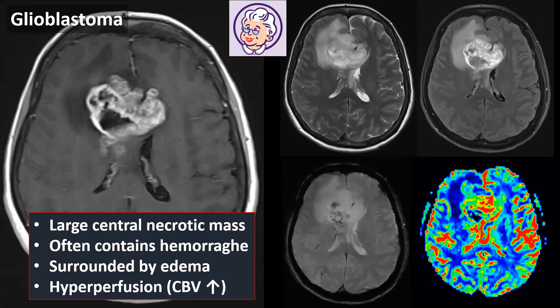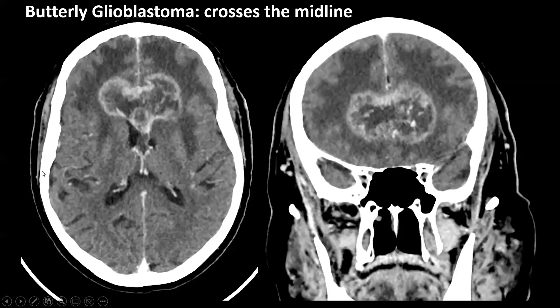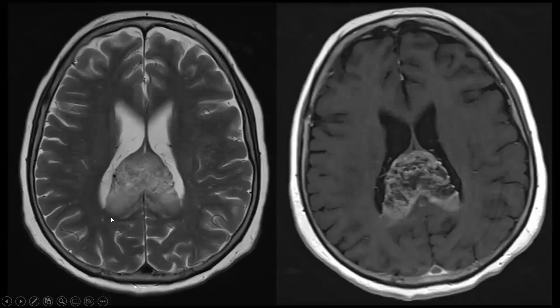The other main intra-axial tumour in adults is glioblastoma, which often presents as a large central necrotic mass, may contain hemorrhage visible on T2-star-weighted images, is often surrounded by oedema, and is associated with hyperperfusion on perfusion-weighted images. Glioblastomas can occur in various locations. So-called butterfly glioblastomas are located centrally in the corpus callosum, crossing the midline — this is not a typical location for metastases as it is not a watershed area.